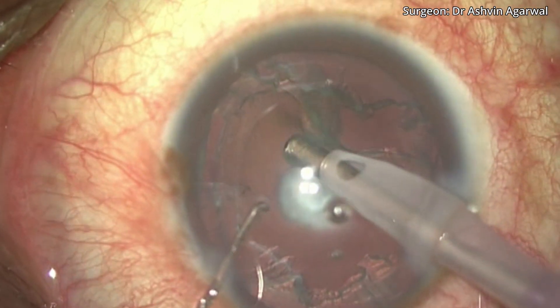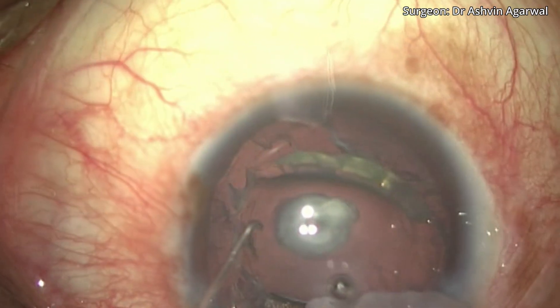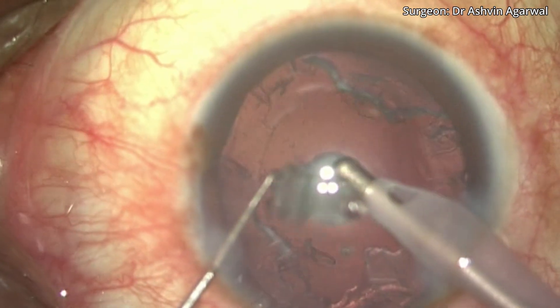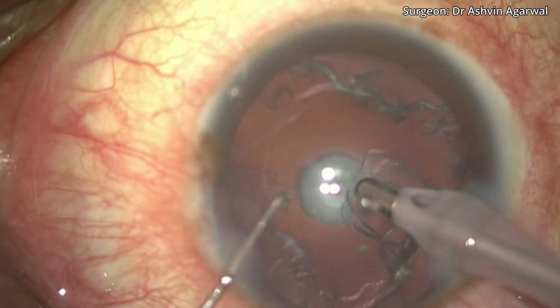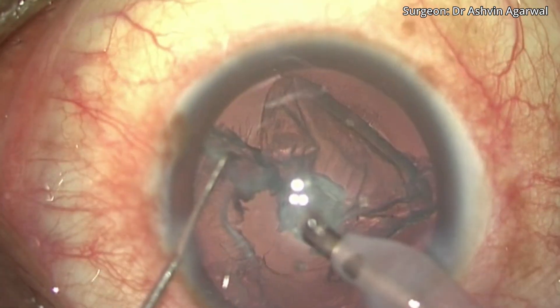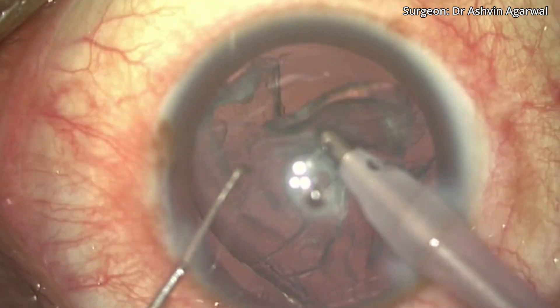This is followed by cortex aspiration, which should be pulled tangentially and not pulled centrally like we usually do. This helps to prevent stress on the zonules and avoids a posterior capsular rupture.